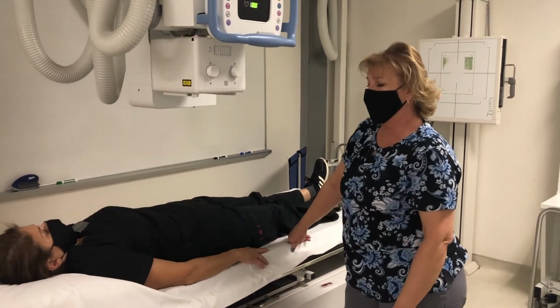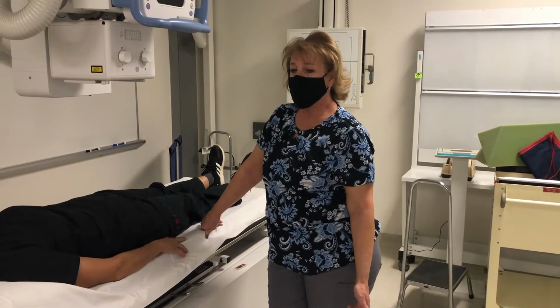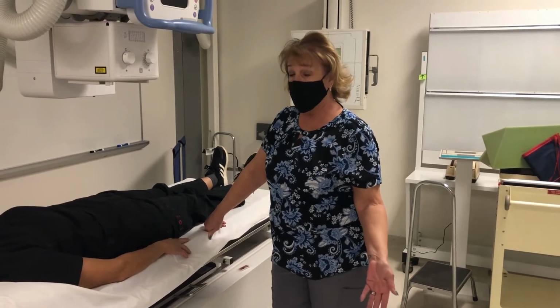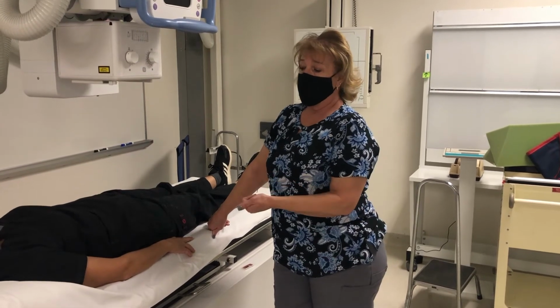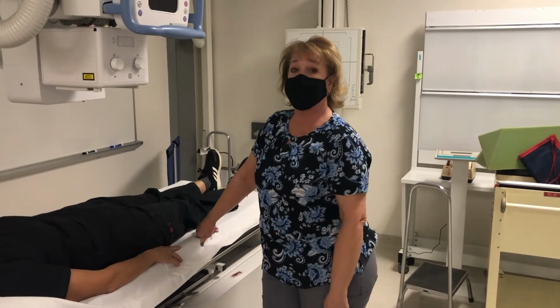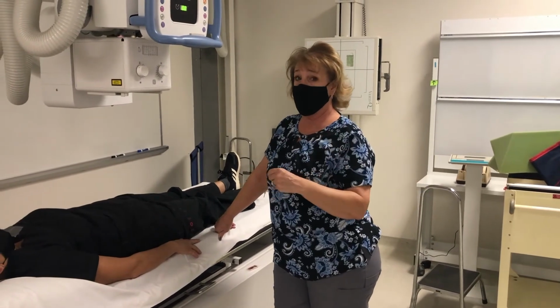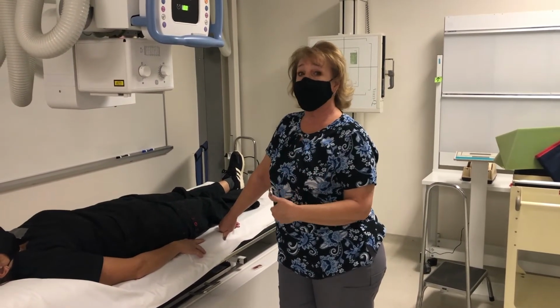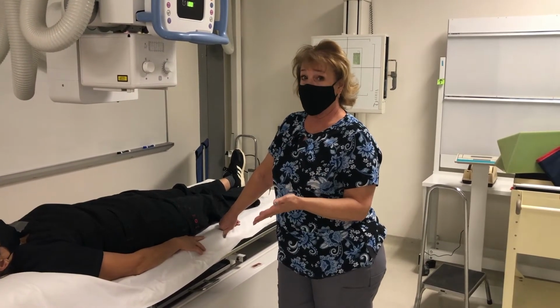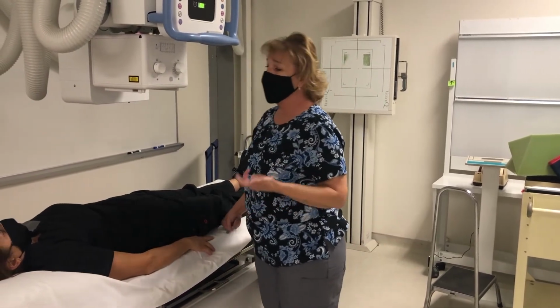Normally the needle's going to stay in the arm for maybe 5 to 10 minutes. And this is not a procedure where you ever leave the room and leave the patient alone. Let's say I just finished a 5-minute film and my next KUB was due at 15 minutes. I wouldn't go to the bathroom, get a cup of coffee, go chat with my friends. I'm going to stay in the room with the patient because I don't know yet if she's gonna have a contrast reaction.